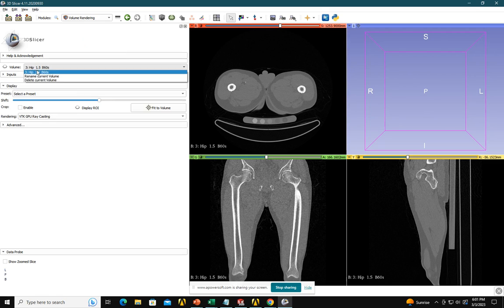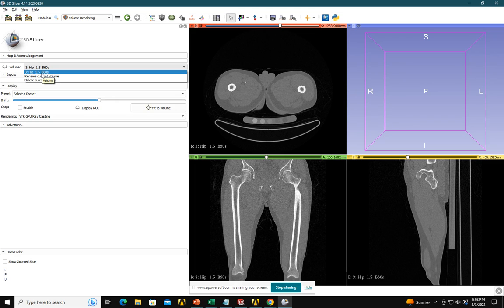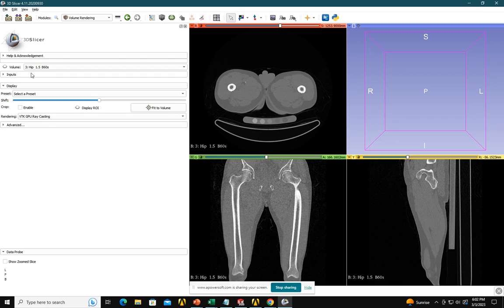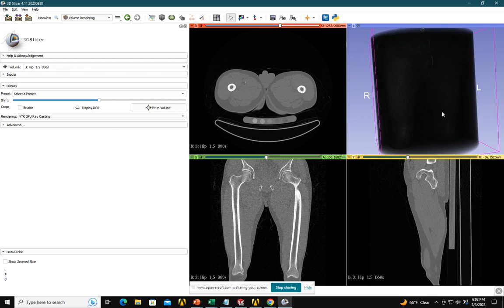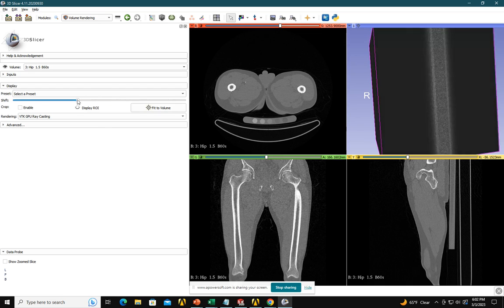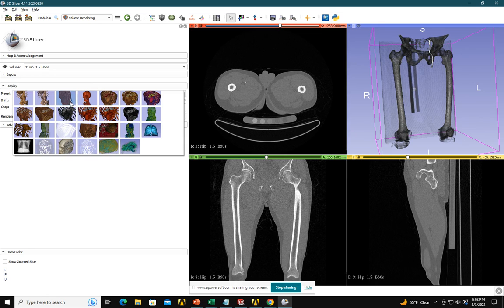To go to the 3D view, we will go here under Volume Rendering. From Volume Rendering, we will select this image. If we import a 3-order image, it will show 3-order images here. Right now we just have 1.5. I'll click on this. Right now somewhere there is a 3D volume but it's not in the center — we have to make it centered. So this is the 3D image. We can change the contrast here by adjusting this.